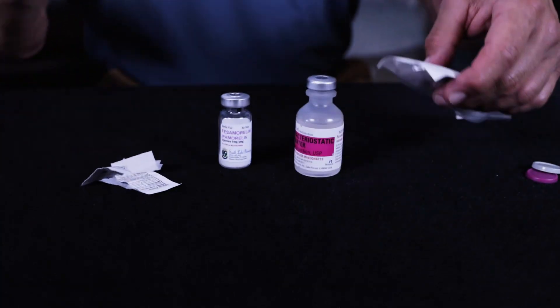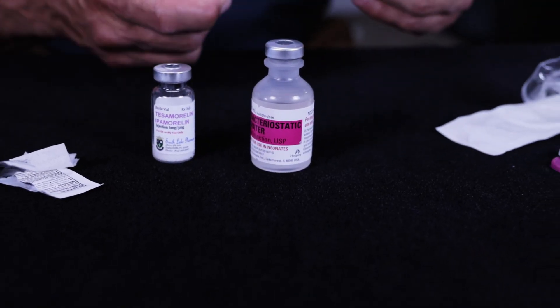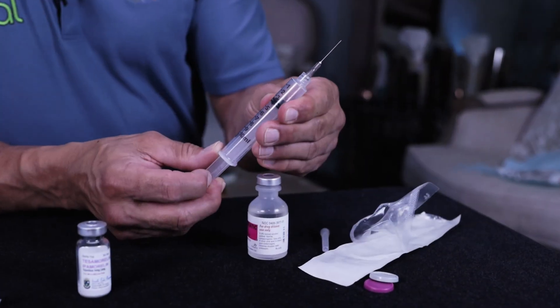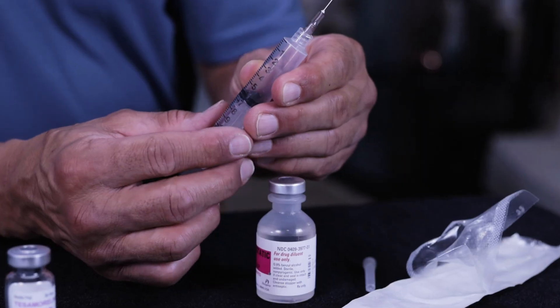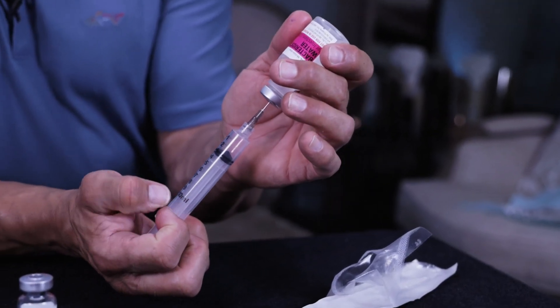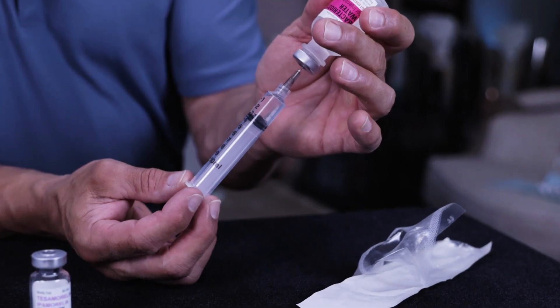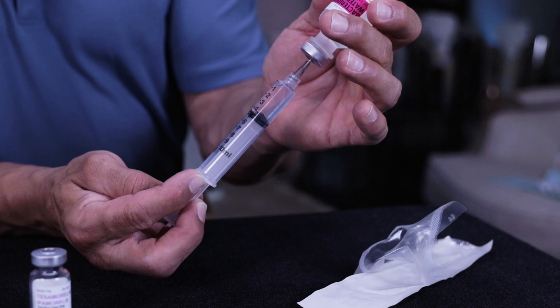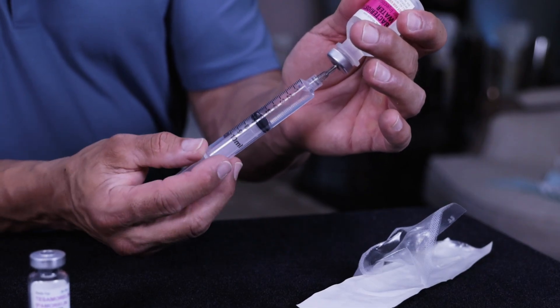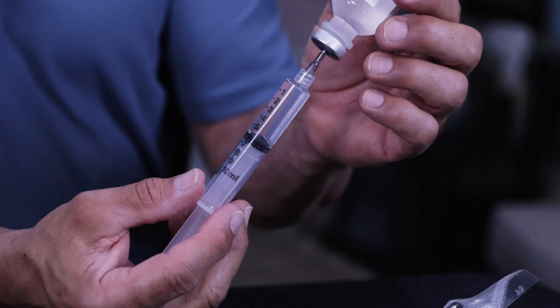Once you have the caps cleaned off, open up this separate syringe they're going to give you for the mixing — you only have one of these in your kit. It's a 10ml because you're going to draw up 6ml of the water to insert into the peptide vial. Introduce 6ml of air, then draw out the 6ml of water. Make sure you have exactly 6ml because any more or less will affect the concentration of the medication.